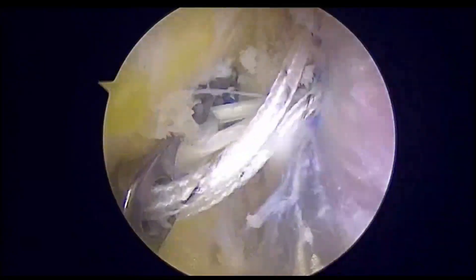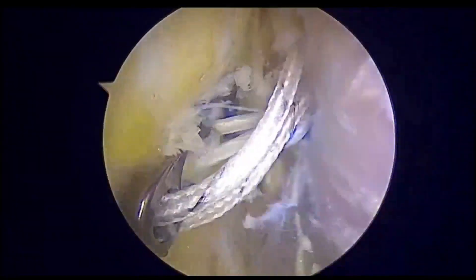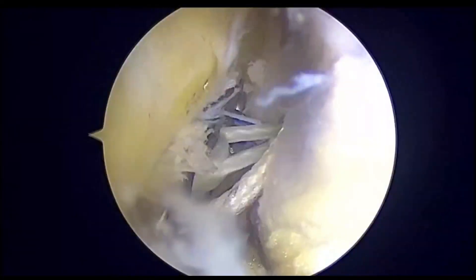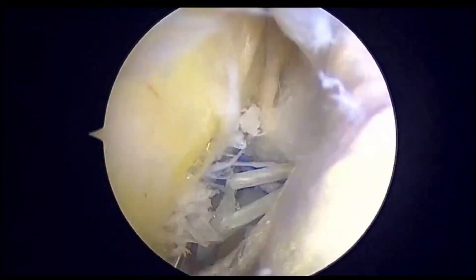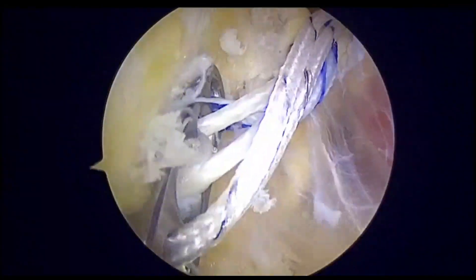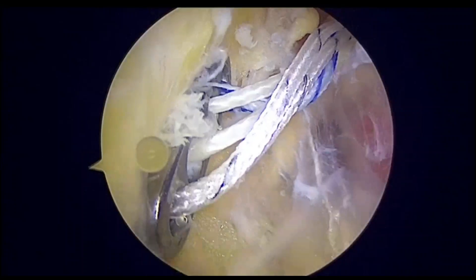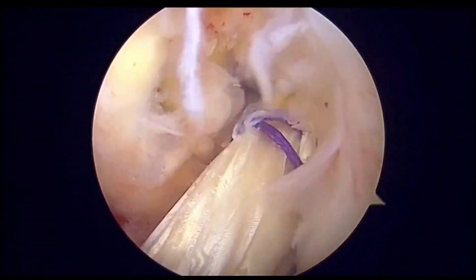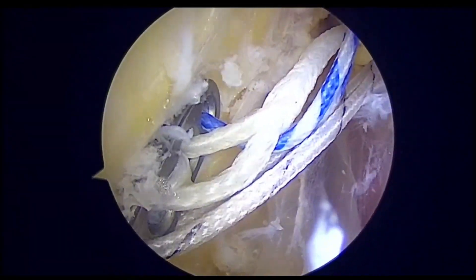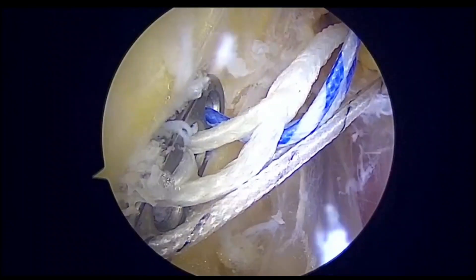We have started to cinch, and you can see that the threads of the button are being cinched and the shortening of the loop is occurring. This causes very nice tension on the graft, and you can see that the blue parts of the suture have gone in.